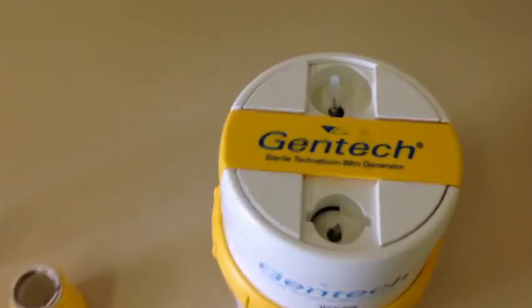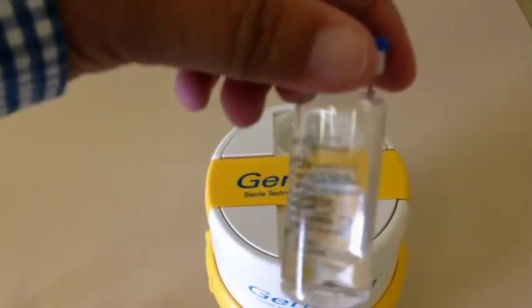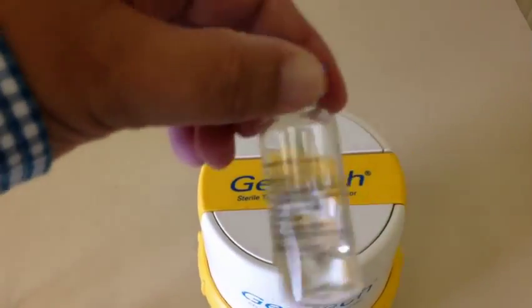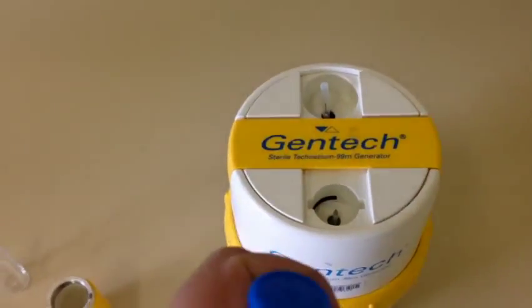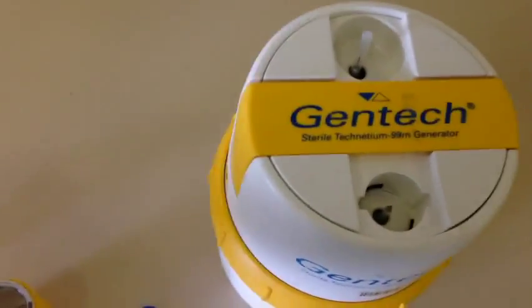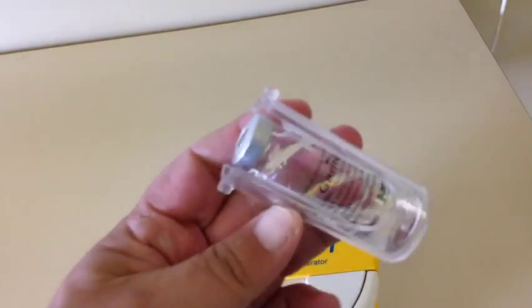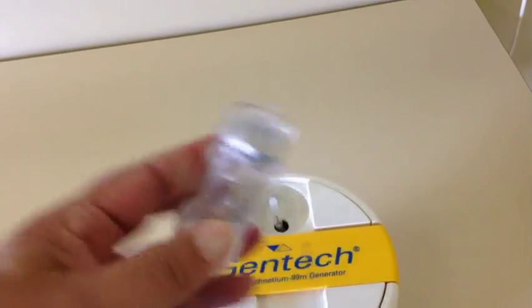And so what we would do is that we would actually have a small volume of saline. So a 40 ml vial with 20 mls of saline in the bottom of it. We'd pop the top of it, put it into this little housing.